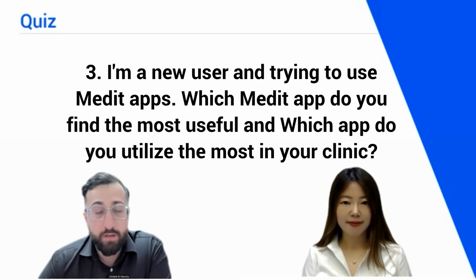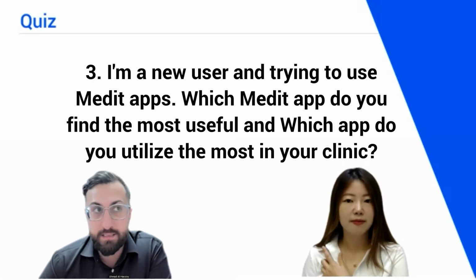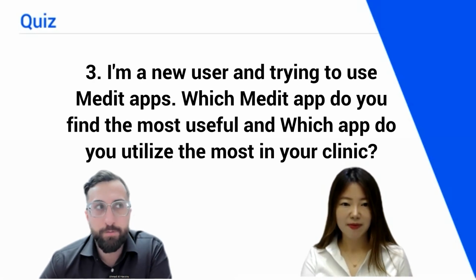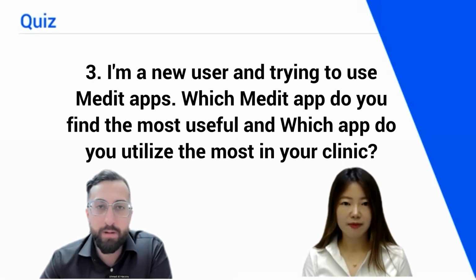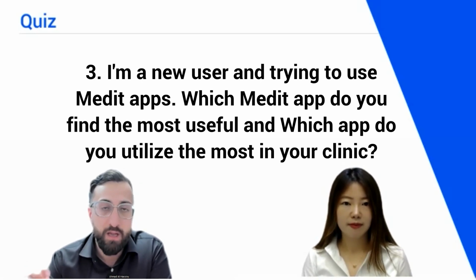To be honest, the most useful is Medit Model Builder by far. I think that is probably one of the best model builders on the entire market. But that's really only useful for you if you're doing something in-house, if you're going to print. If you don't have a printer, Medit Model Builder isn't that useful for you. If you're just wanting a communication tool, I would get very comfortable using the Orthodontic Simulator and Smile Design. Those are 2 very powerful apps if you train and learn how to use them properly.